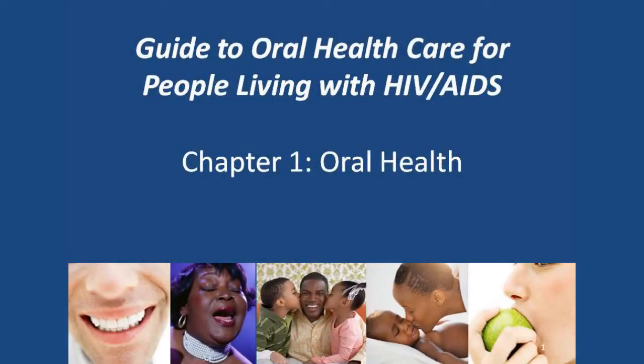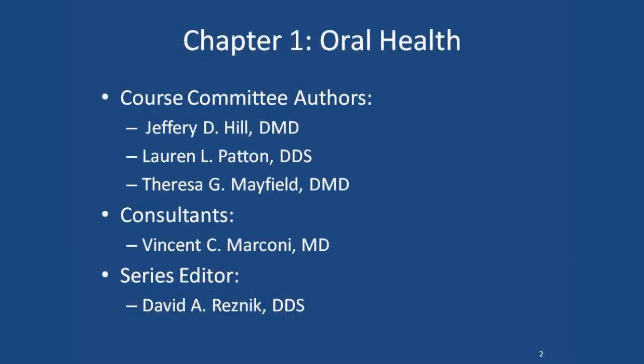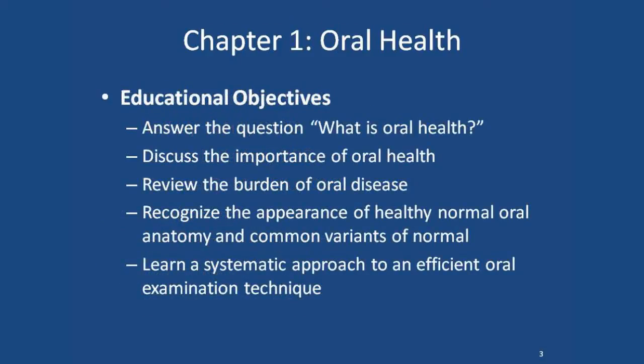So today we're going to be demonstrating how to do an intraoral exam for your patients. We would like to first make sure that we have all the things that we're going to need, which would be gloves and a light source, which could be a light on the wall in the exam room or a pin light. Either one would be fine. And you'll need something to use as a tongue depressor, either an actual tongue depressor or a disposable intraoral mirror would be helpful as well.